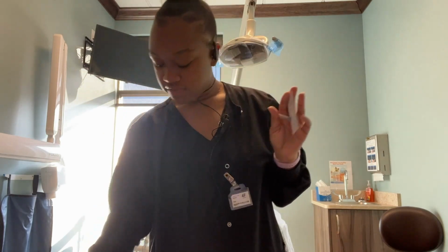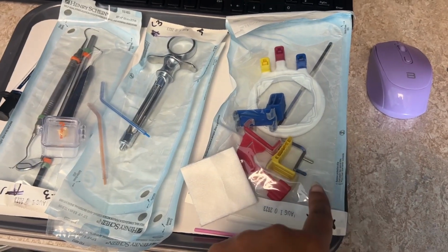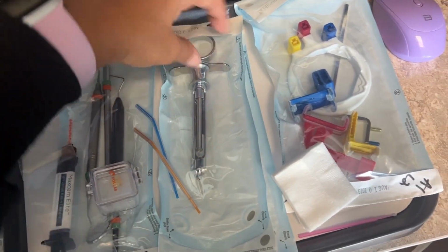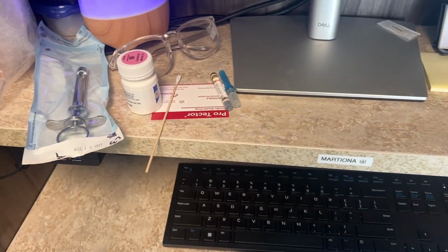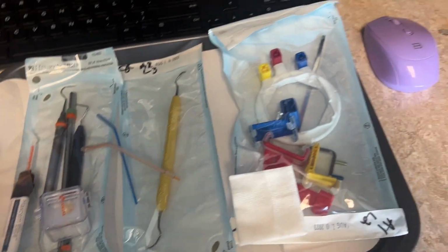So typically we don't have to numb them, but just in case we do, I'm gonna go ahead and get it out. If they're a little sensitive, we have our XCP to take a bite with, make sure everything fits good. The cement, air water, sensor cover, and then the syringe if we need it. That's my anesthetic setup, and then we're just gonna clean it off with this and seat it, and we'll be good to go.